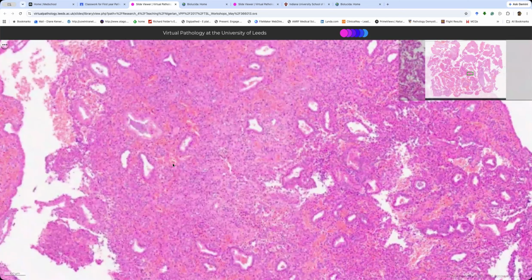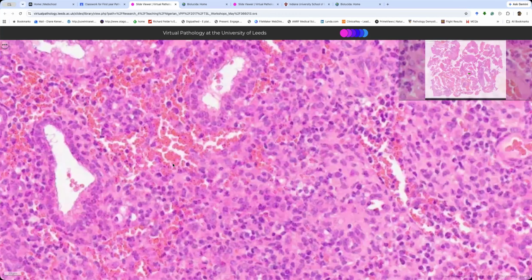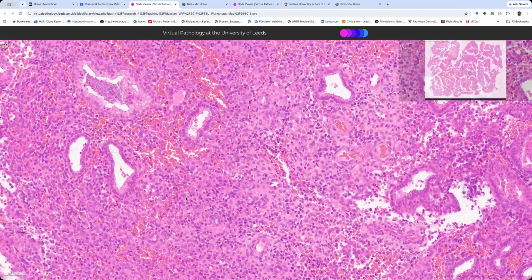So why do I think it's breakdown? Okay, I think it's breakdown because there should be a whole lot of blood and neutrophils here. So unlike other parts of the body, neutrophils in the endometrium does not mean acute inflammation. Neutrophils in the endometrium means menstrual phase. While a lot of the glands are kind of inactive, we do have the remnants of secretory stuff here. So we call these slightly inactive glands exhausted secretory glands, and these are the remains of the secretory glands.